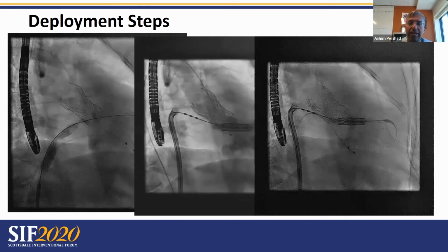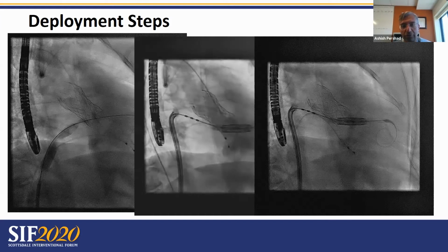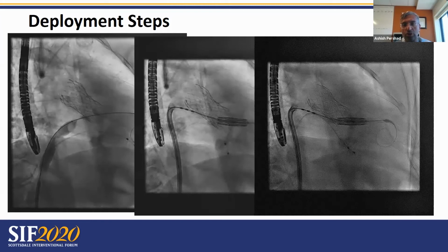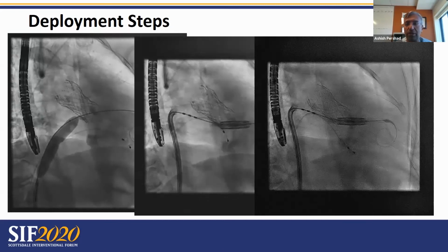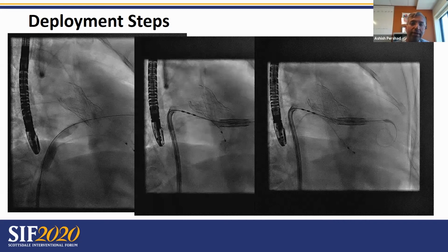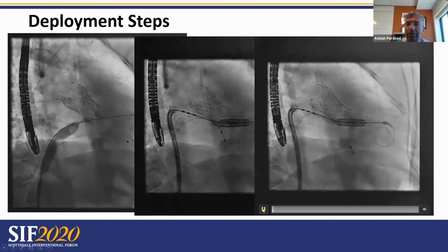Typically, we would like to keep our pusher on the left side, but in this case, as you can see, the pusher is pulled a little further back than we'd like. Care needs to be taken to make sure that the pusher is not on the right side of the heart and is maintained within the left atrium, past the interatrial septum, in case adjustments need to be made once the valve is ready to be deployed. Moving on to the final deployment process shown in the right panel.